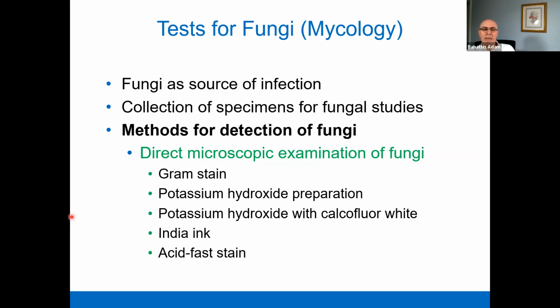you cannot let them grow in all the mediums. There is a special medium for fungi, okay, and the methods for detection are different. Direct microscopic examination of fungi is the most common one, and the easiest and also cheapest technique that we are using to identify fungi.